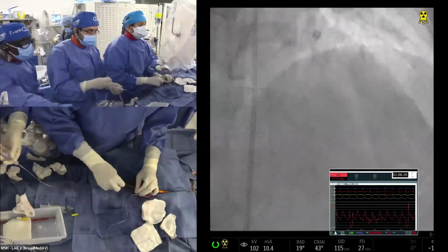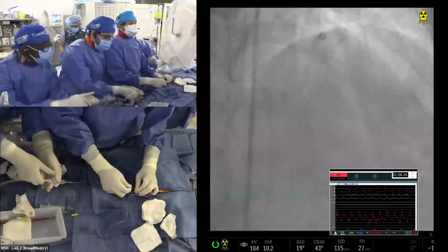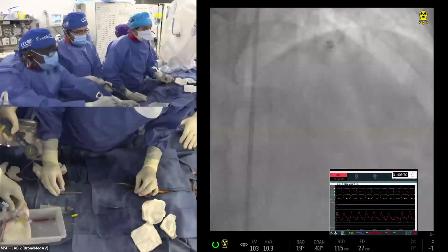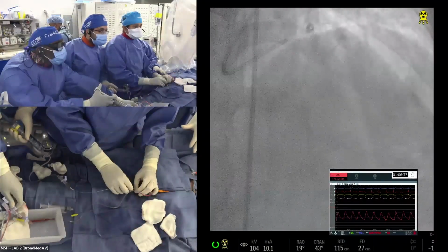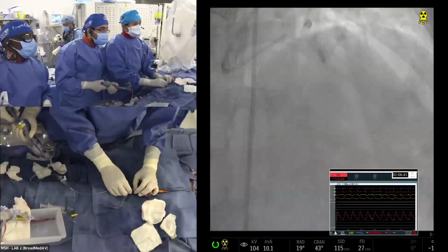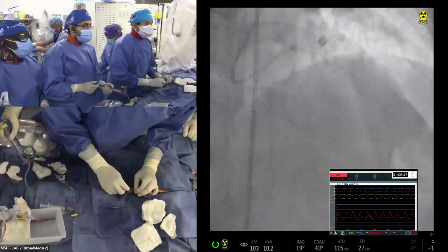So the question was, why do you want to do any balloon before stenting? Maybe just leave it here and go. But I think we learned that they do quite well. With a good atherectomy, you have done the rotablation and then you do the atherotomy with this balloon. You have to go a little distal also. But don't go more than 10, 12 atmospheres. Now many people go to very high pressure, which is okay.